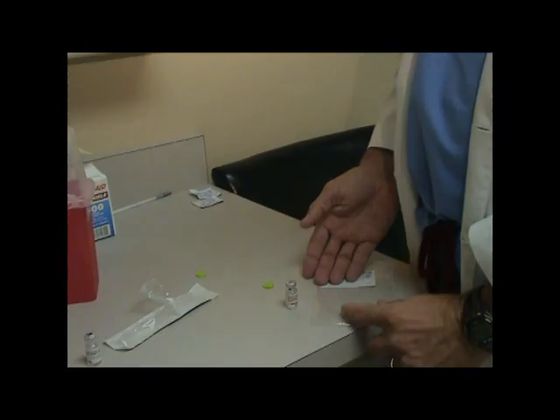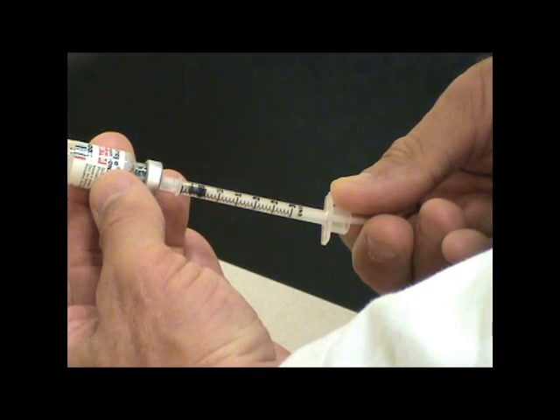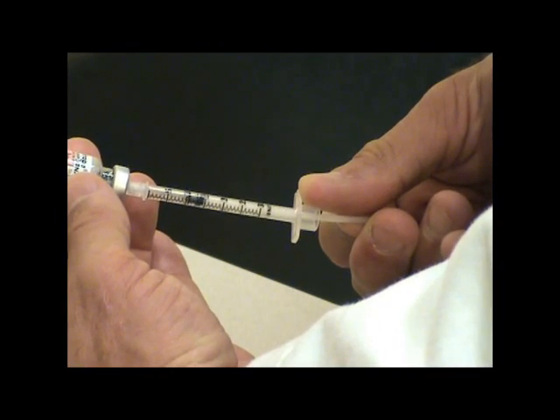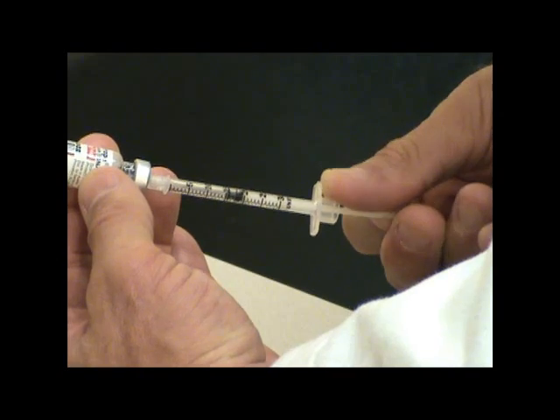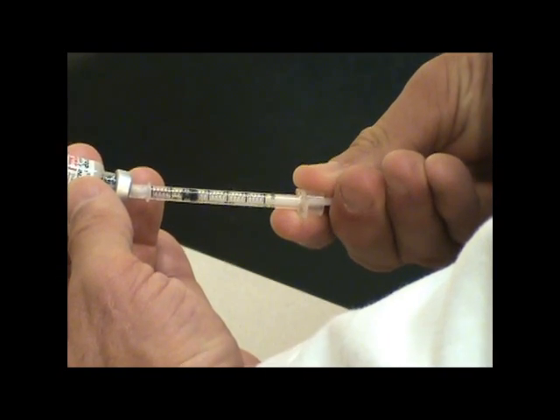Then you're ready for injection. Drawing up the Omnitrope, you're only going to use a very small amount. I like to aspirate it all the way up to about the 10 or 15 mark and then push back. You're only going to go to the 7 mark.